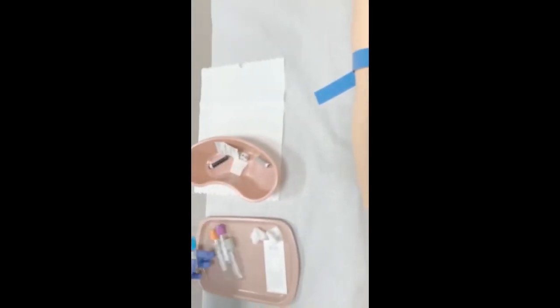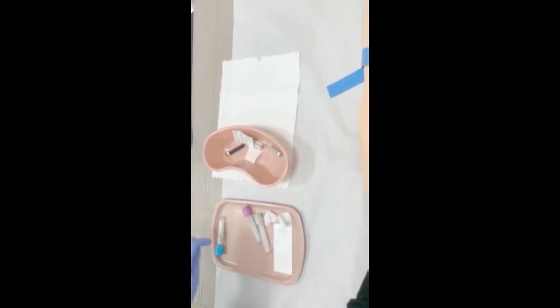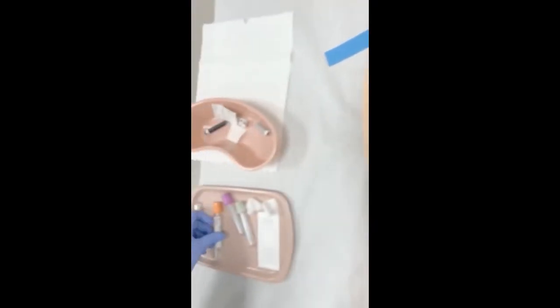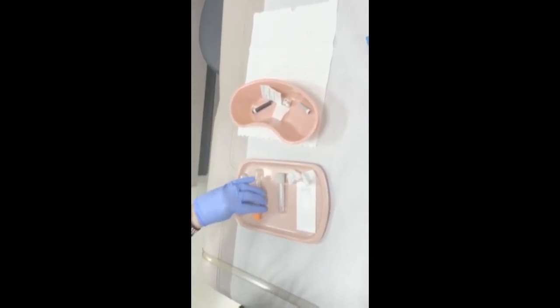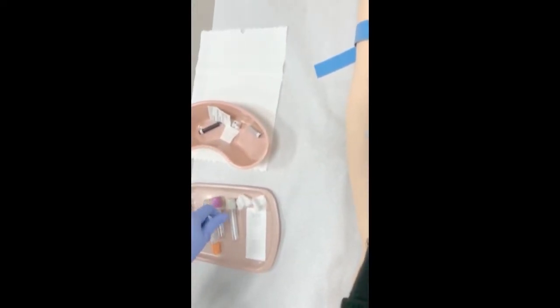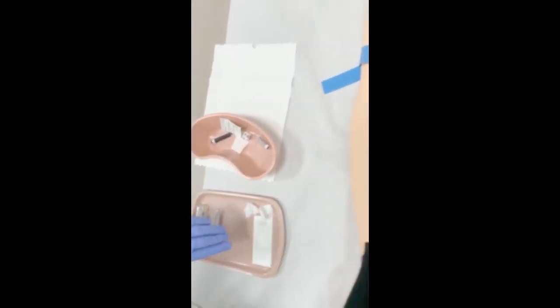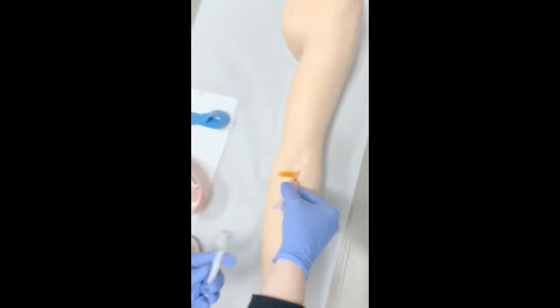Remove the first tube and set it aside — we're not going to do anything with it yet. Get the next tube in there, and while that tube is filling, invert the previous tube. The sodium citrate is being inverted while our thrombin is being filled. Now the thrombin is filled — remove that tube and grab our EDTA, put that in, and invert our thrombin tube. We have a few seconds between each tube fill, so that's sufficient time to invert. Take out the EDTA and get the oxalate in. Before removing the oxalate tube, first remove the tourniquet and set it aside.